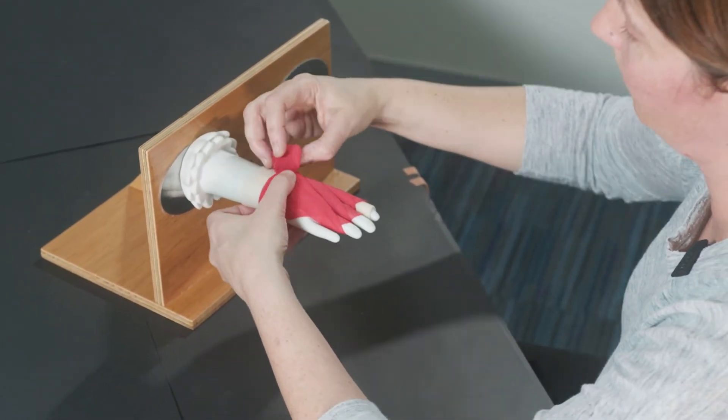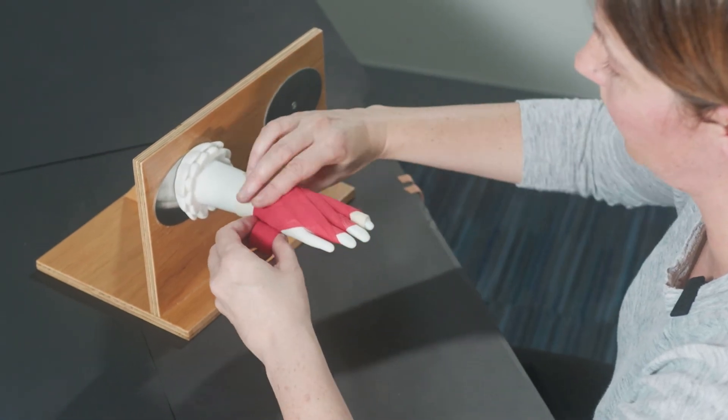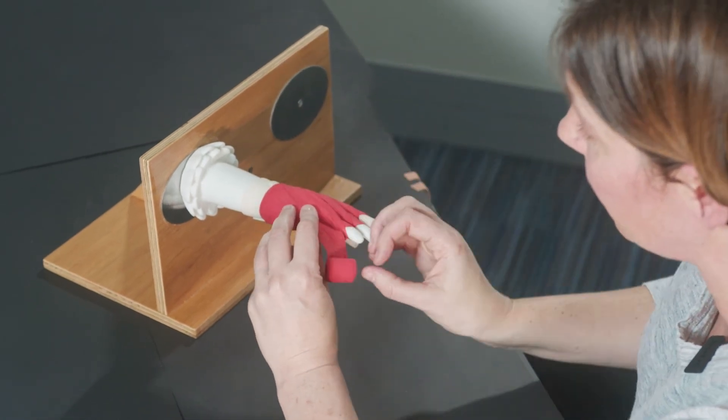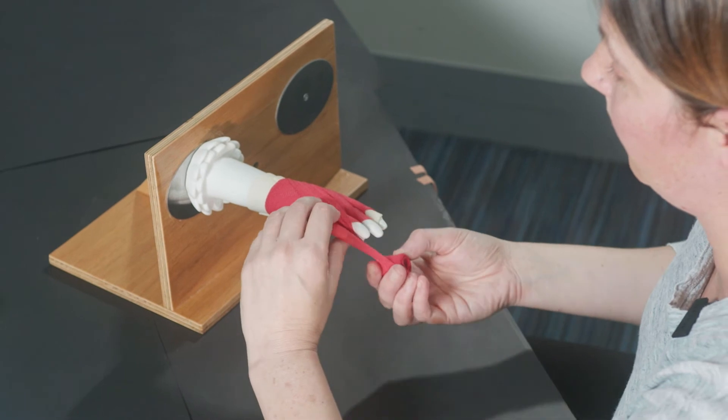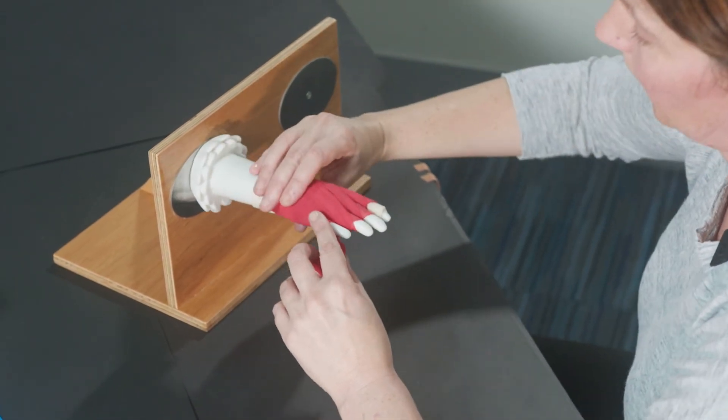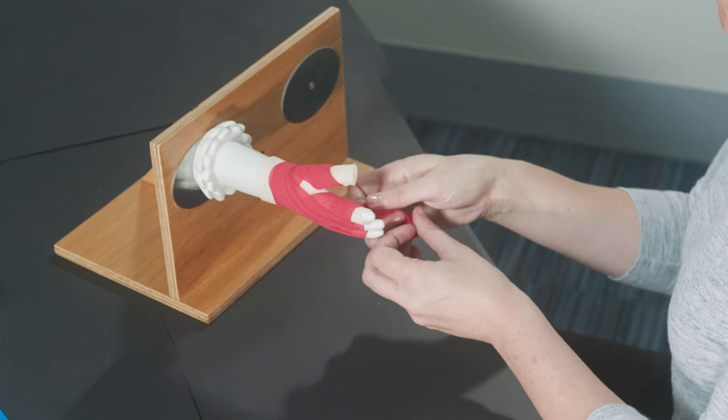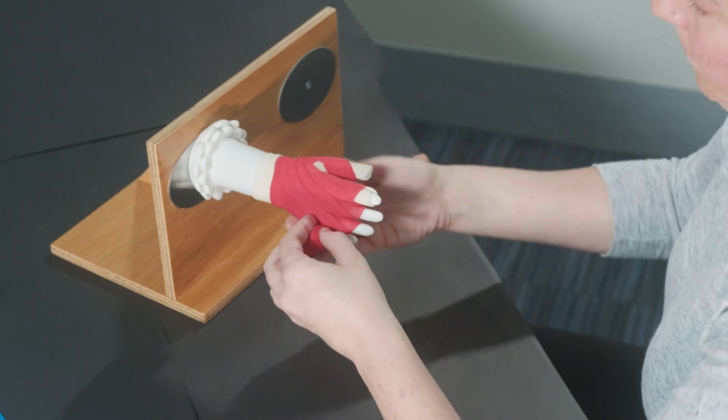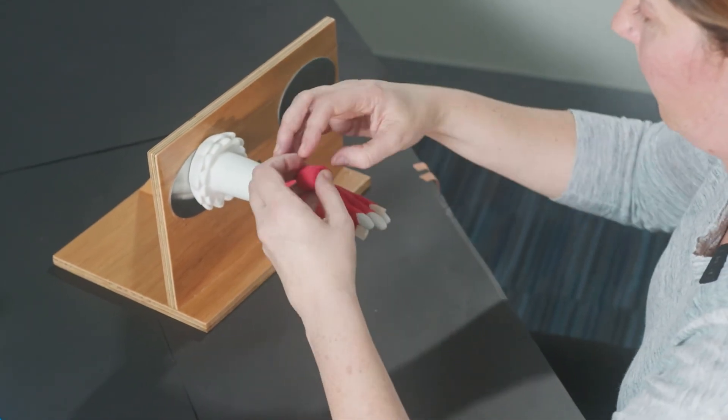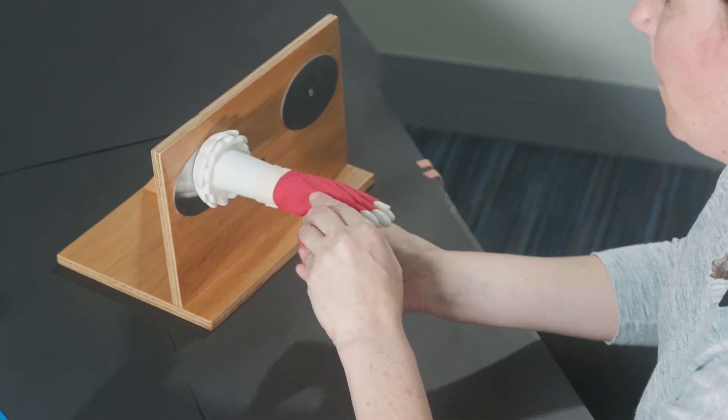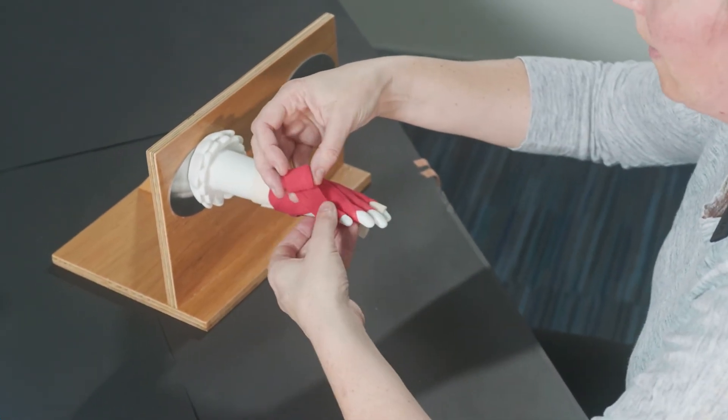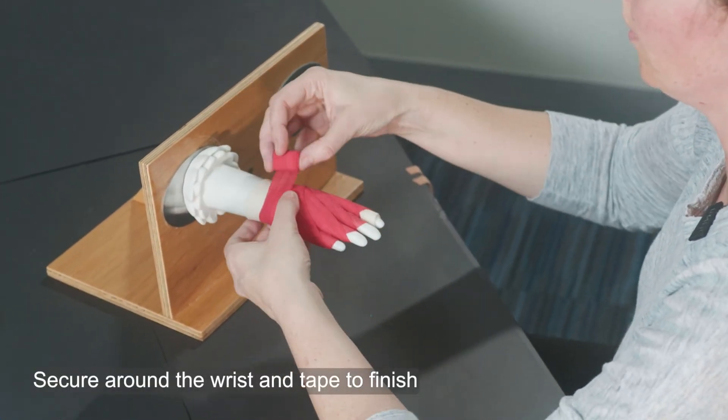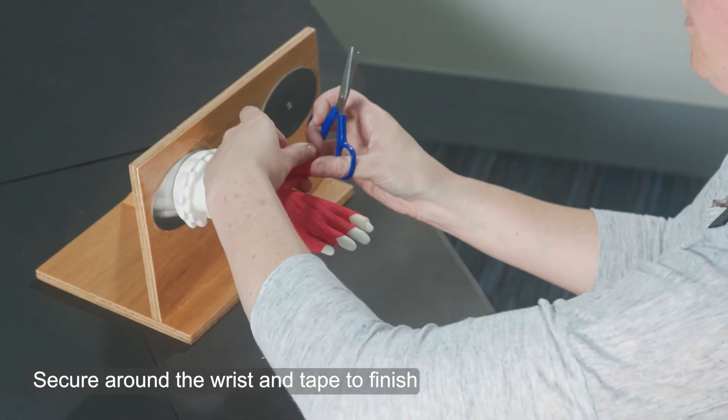We're going to do our little finger now, so starting on the thumb side of the finger, securing your bandage. Again, I can feel that maybe has a kink in it, so I'm going to come back and just fix that up so it's nice and flat. Around we go, just that one time, and down the back of the hand again, not pulling too tightly. We might go once around the wrist just to secure everything in place.